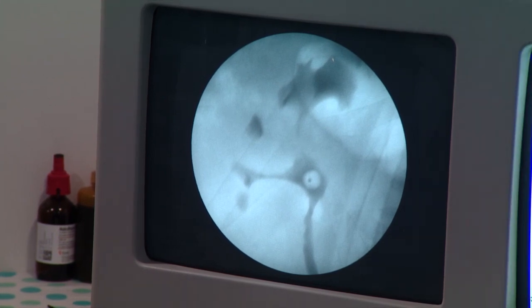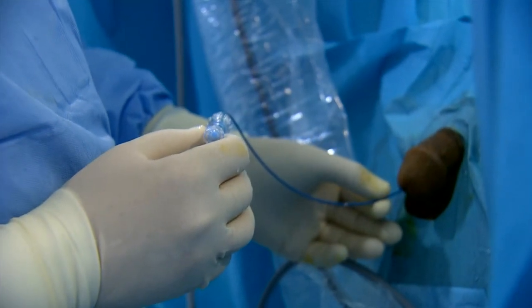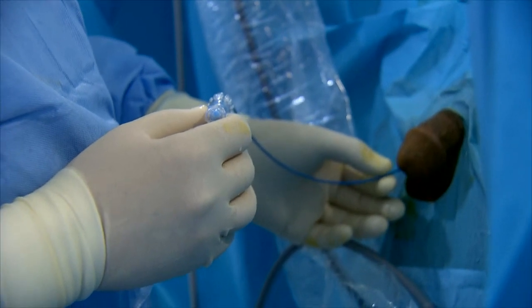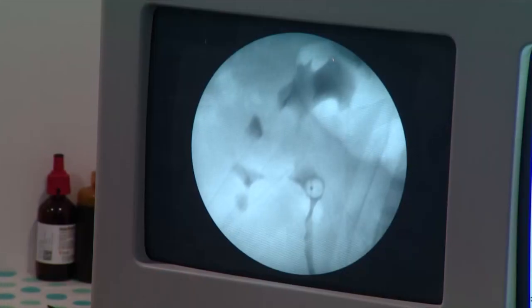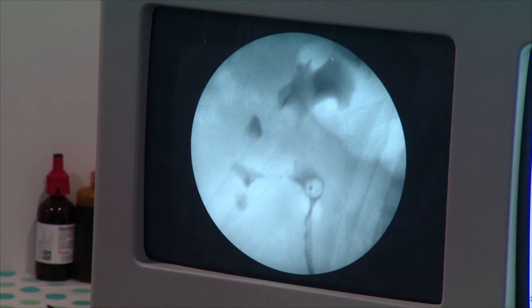We tighten the screws, and now we make our final demonstration of the position. Please show X-ray. Yes, this is now the position of the balloon above the ureteropelvic junction. This balloon facilitates a certain dilation of the calyceal system in order to make the puncture easier. And the second point is that the balloon avoids any migration of small fragments to the ureter. This is the main reason why we are using this.